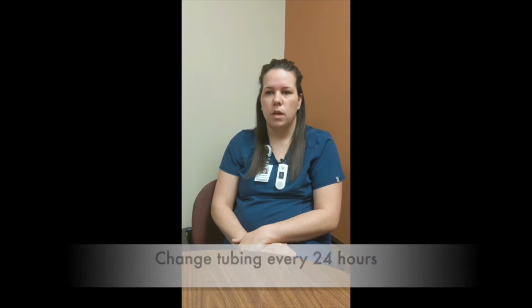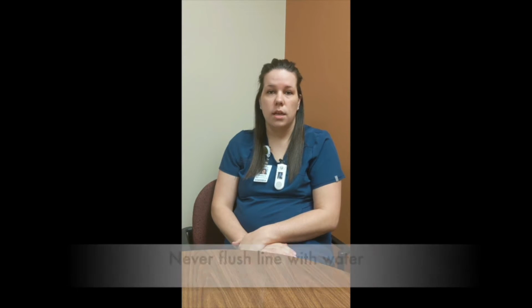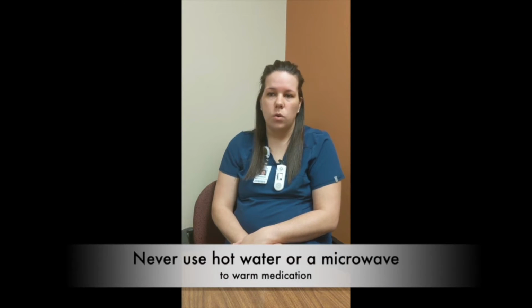General information. Change tubing every 24 hours. Use new syringes with each flush of sodium chloride. Never flush your line with water. Use new alcohol swabs with each cleaning of the clave connector. Never use hot water or a microwave to warm your medication.